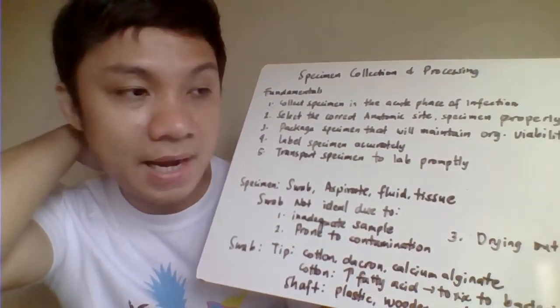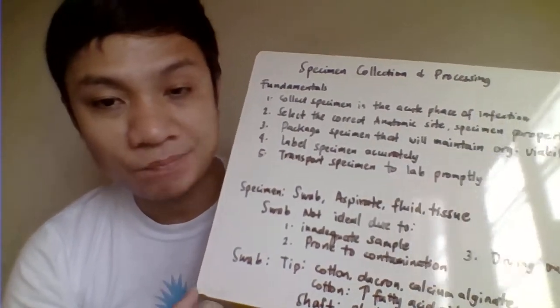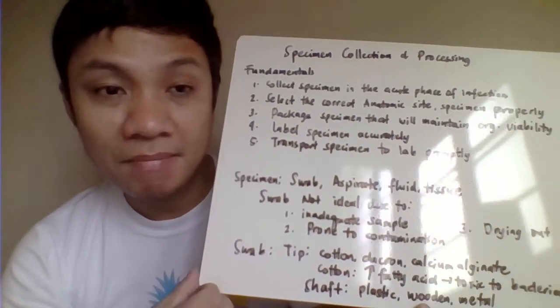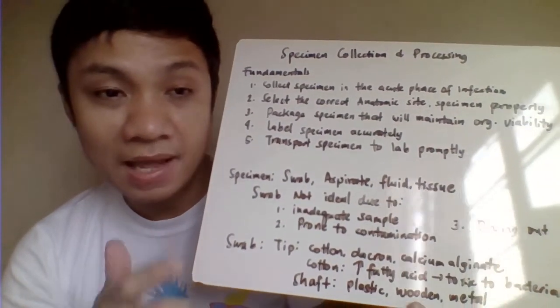Another one is drying out. The swab is prone to drying out. When your swab dries out already, it becomes harsh to your microorganisms and they might die because of the drying out. If our organisms die, it means our result will be negative.